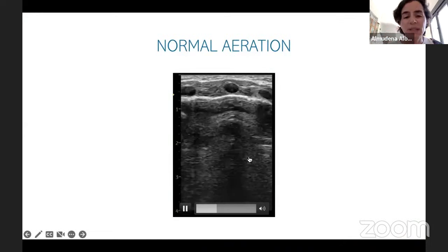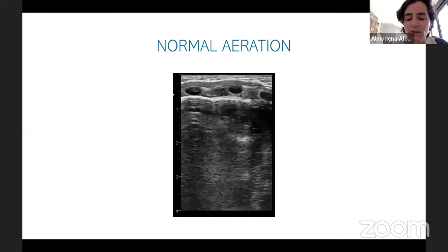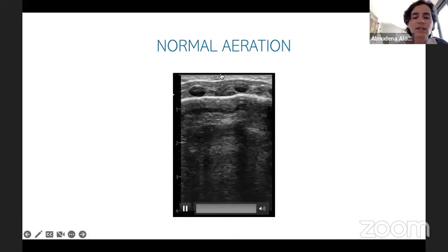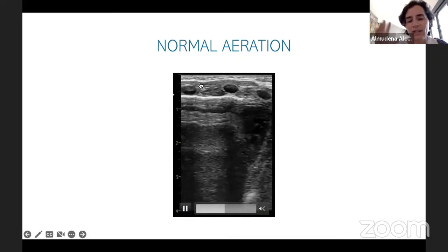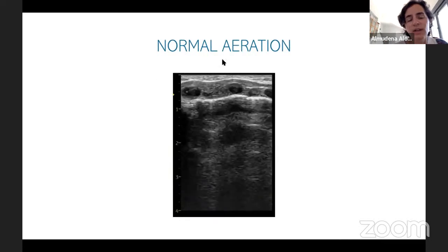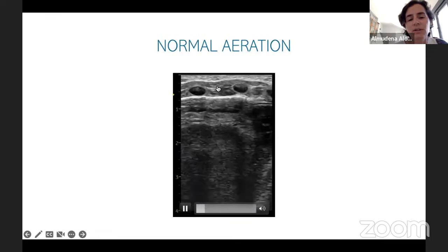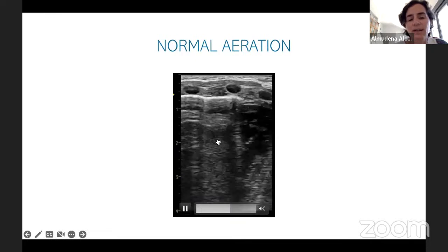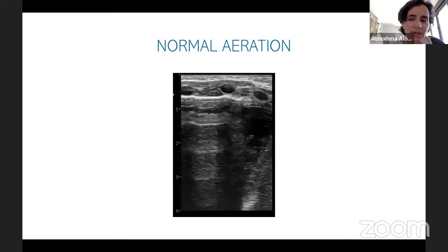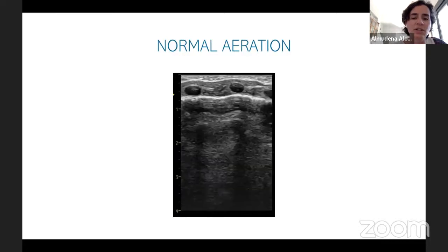The first thing will be to talk about normal aeration after birth in preterm infants using lung ultrasound. You all know now in this part of the course that you have to see more or less this image. This is the concept of normal aeration that we have at all ages, not just in newborns. We have the subcutaneous tissue here, the ribs, intercostal muscles, then the pleural line, these A lines, no B lines. But this is not normal in the first hours of life, as you all know when you begin to perform lung ultrasound exams in your patients.